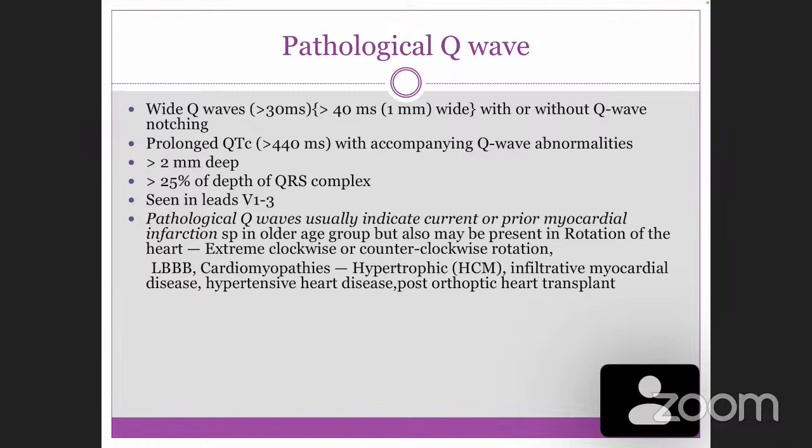But now, more than 30 milliseconds is considered significant. And it is more than 2 millimeter deep and more than 25% of the depth of the QRS complex.